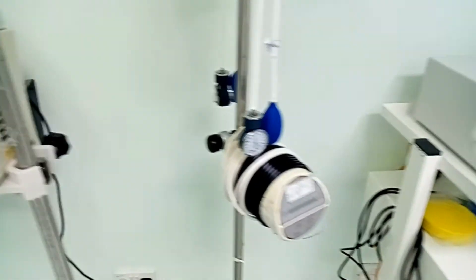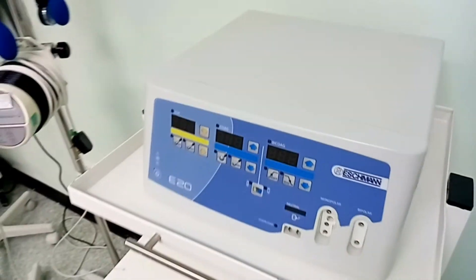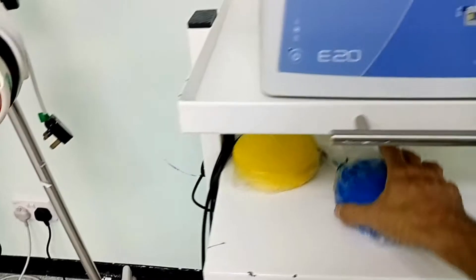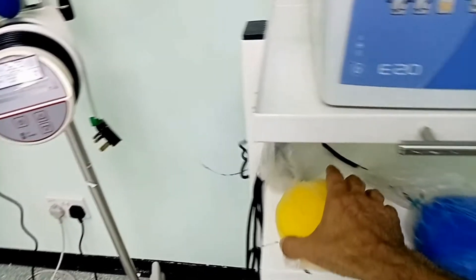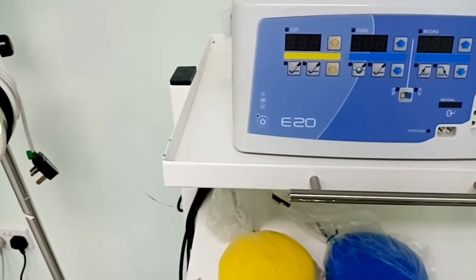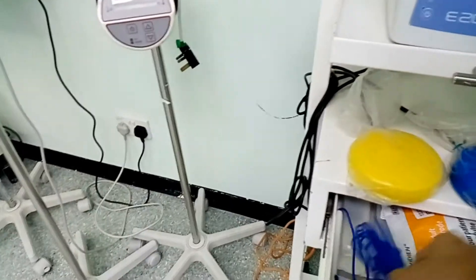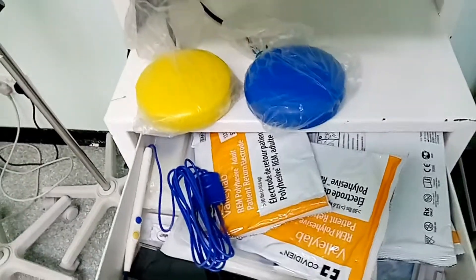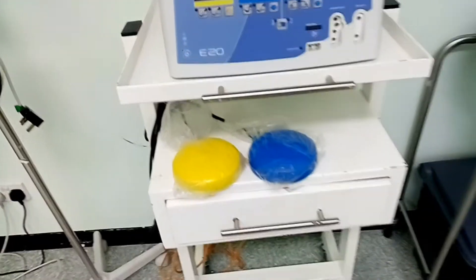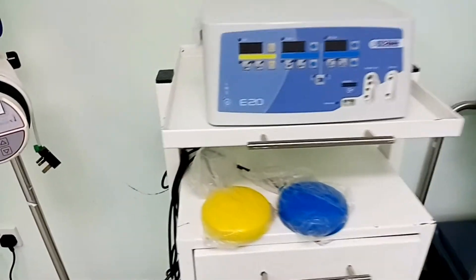كل التجهيزات دي في حالة الاستخدام تكون ستاند باي وجاهزة. ده جهاز الداياثيرمي أو الكي والقطع الجراحي، بيستخدم حالياً في جميع العمليات الجراحية. أقدر أستخدم الفوت سويتش بقدمي: اللون الأصفر للكي، واللون الأزرق مثلاً للقطع. وممكن أستخدم عن طريق الهاند بيس اللي بيتركب فيها الجزء المستخدم كمشرط. بالتفصيل سنوضح الأمور دي كاملاً إن شاء الله.